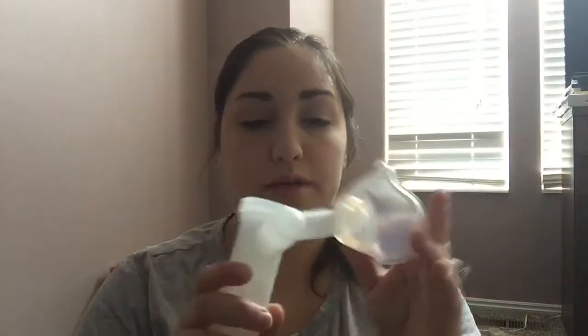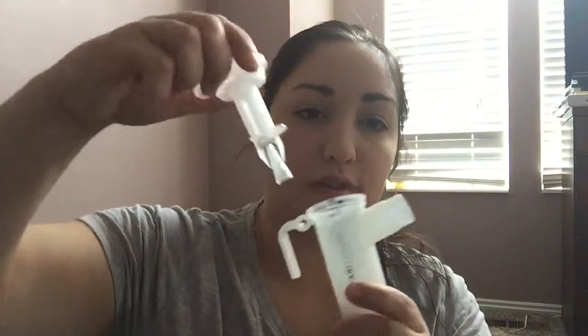This little Pari cup comes apart in several different places. The elbow comes off, the little top comes off, which, by the way, this little blue part comes off too. I didn't even know that until, I don't know, 5 months in. I know, that's awful, right? So yeah, that little blue part comes off, and this just twists right out.